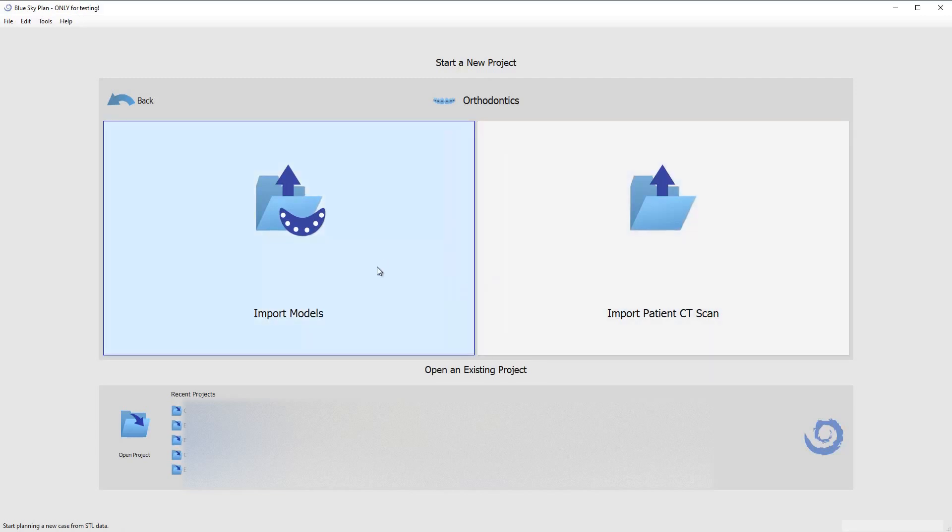Most people aren't going to use that but there are select cases where we really want to know how much bone volume we have to work with. So this is your option if you want to do that. For this example I'm going to be using import models.